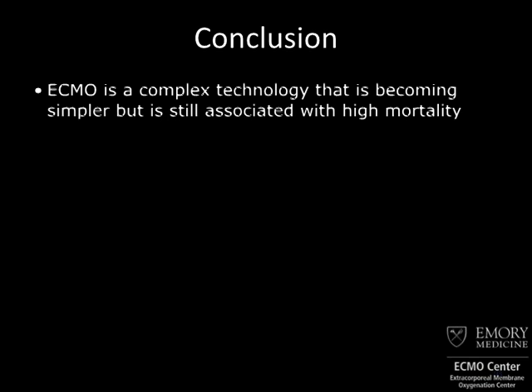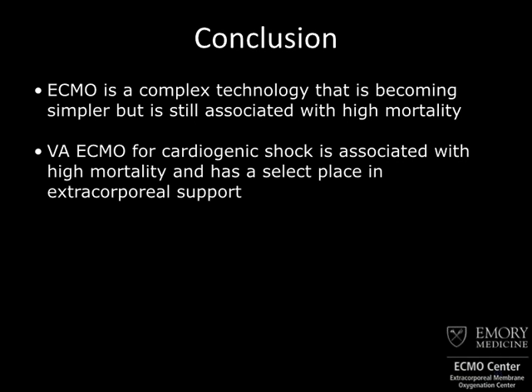So, in conclusion, and ending precisely at 7 p.m., I think we can say that ECMO is a very complex technology. It's becoming simpler, but it's not quite there. I don't think everybody will be doing this in every hospital anytime in the near future. VA ECMO for cardiogenic shock is associated with really high mortality, and it has a select place in extracorporeal support, and it's important to think about what technology you're going to implement. Just reaching for ECMO will get you out of the jam, but it may not be the best solution for all patients.